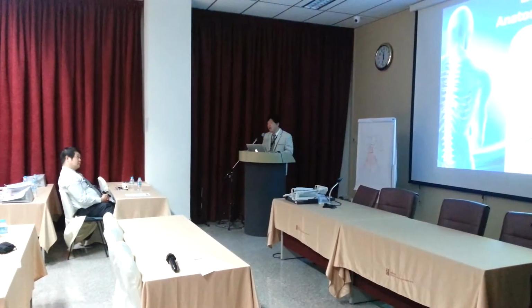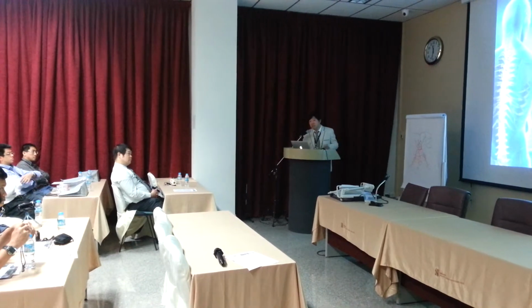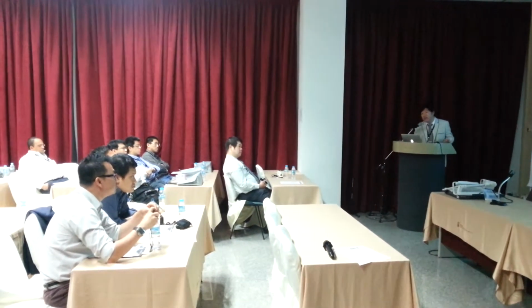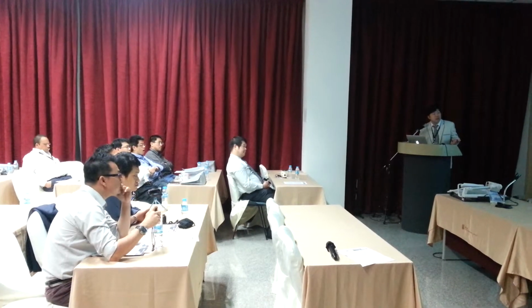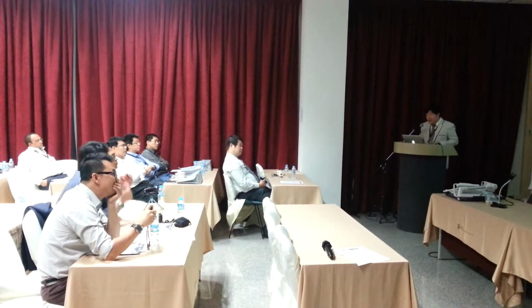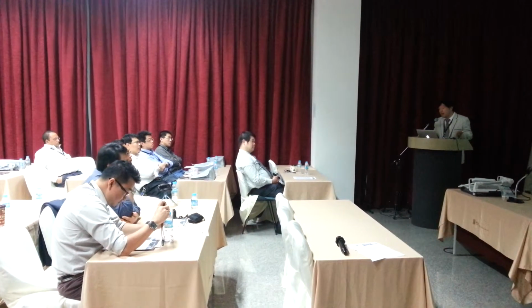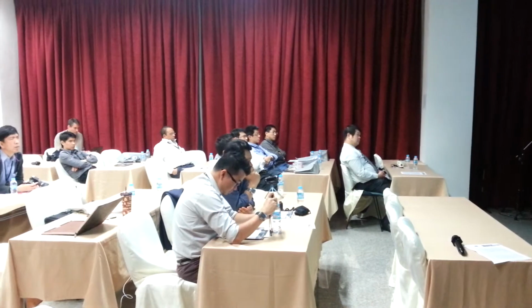The limitation of this technique is anatomical distortion, which may come from many factors, mostly severe degeneration, severe scoliosis, facet hypertrophy, high-grade spondylolisthesis. In some cases fracture dislocation involves this area, and anomalies. This picture shows a case of severe degeneration, so it is very hard to determine the facet orientation and the mammillary process. The next technique is the funnel technique.